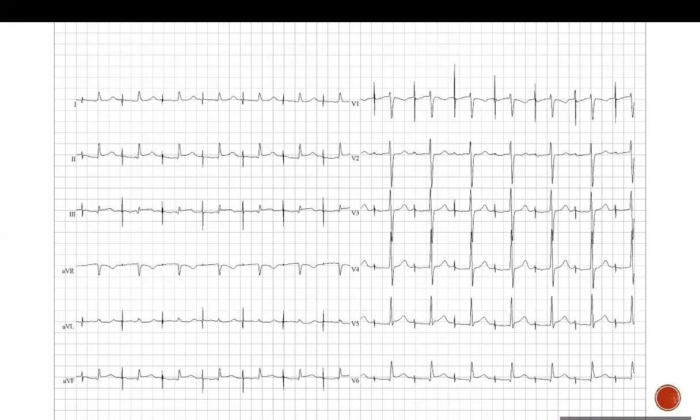Okay, so a single chamber atrial pacemaker is rare. As I was saying a little while ago, it's a limited number of the population in whom you would take the risk of putting only a single chamber device in the atrium. So at least, yes, it's behaving like a single chamber device in the atrium. At least now it's pacing in AAI mode. I can't definitely say this is not a dual chamber device just because we don't see any evidence of the RV functioning. We're good here. It's clear, Doctor.